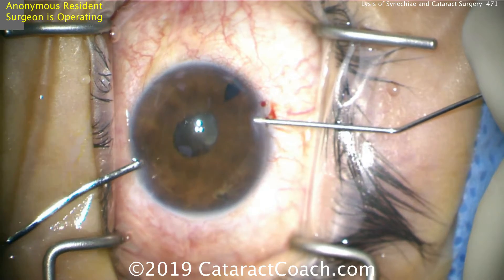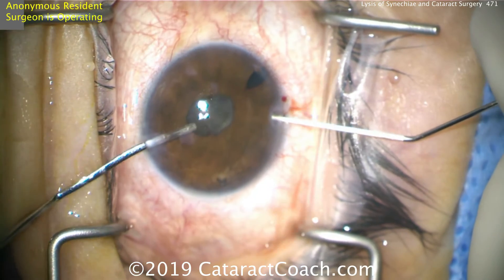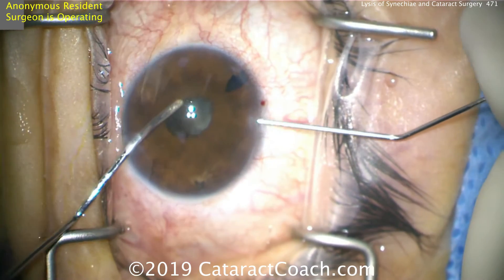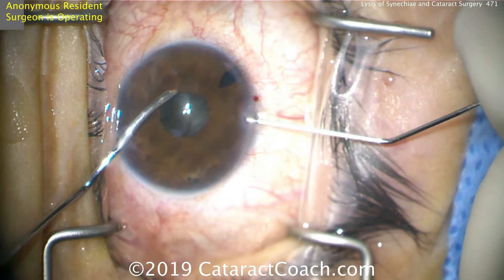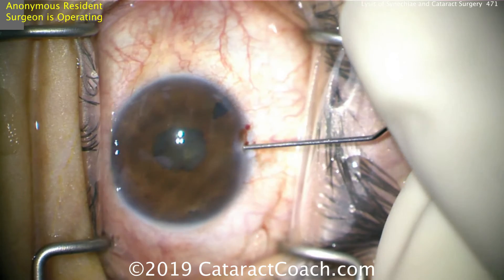Keeping the eye inflated, an anonymous resident here is operating. She's going to go underneath there nice and easy and move that back and forth — getting underneath there, very good. That'll separate out all those attachments. So now the pupil's still small, but at least it's separated from the anterior lens capsule.